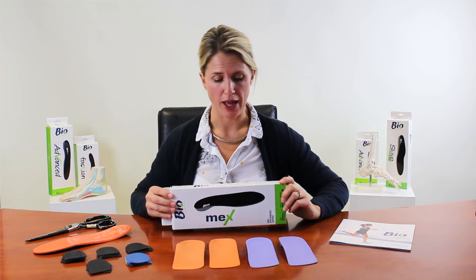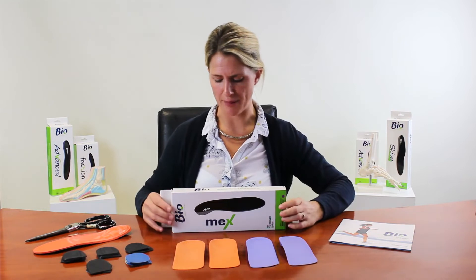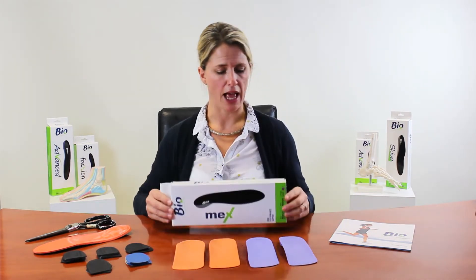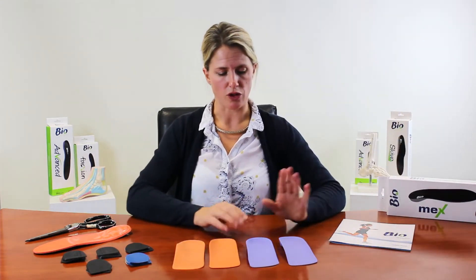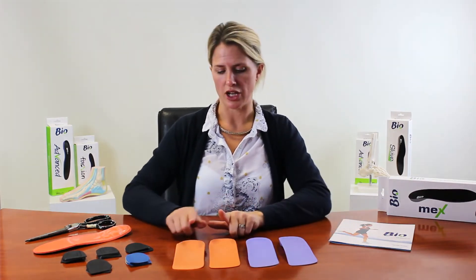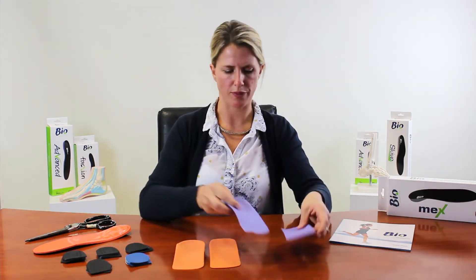This is a short video about the Biomex prefabricated orthotic, which is part of the Bio Prefab range. Biomex comes in a little box and there are four different types: two different densities — low density, identified by purple, and high density, which is orange — and within those two densities, two different arch heights: low arch and medium arch.